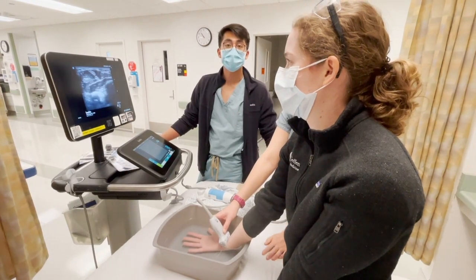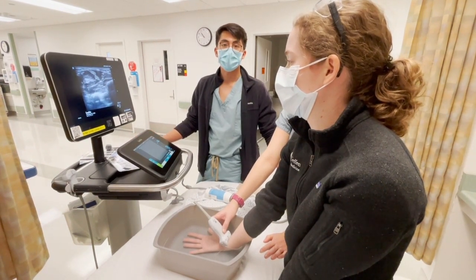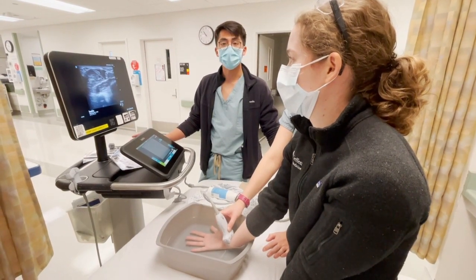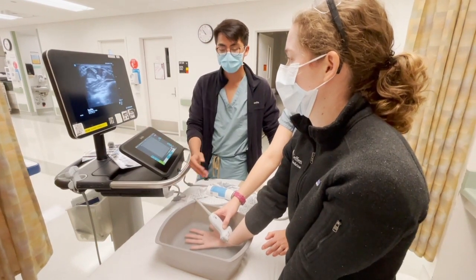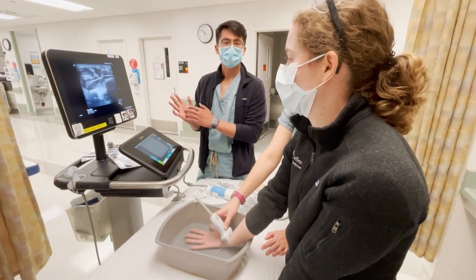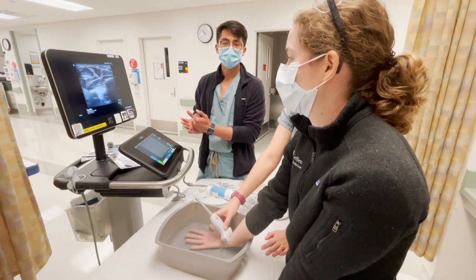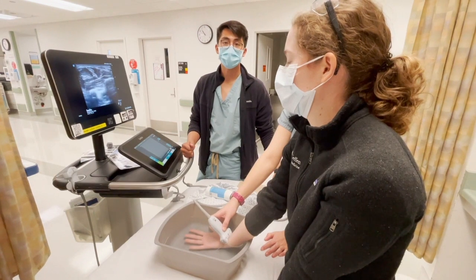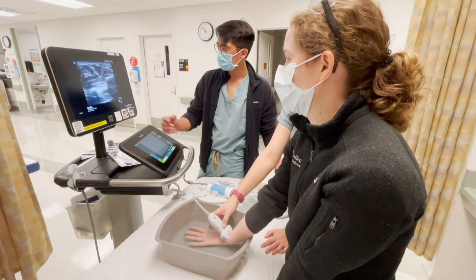We have a 26-year-old female presenting with hand pain, swelling, and a fever. Initial x-ray findings of the hand were clear, so we want to get a hand ultrasound. We're using a water bath for this hand ultrasound because the hand has irregular surfaces — we use the water as a medium for the ultrasound waves to pass through. We'll start at the level of the wrist.